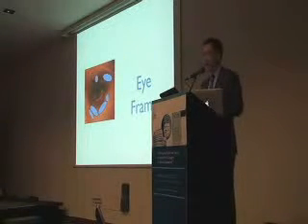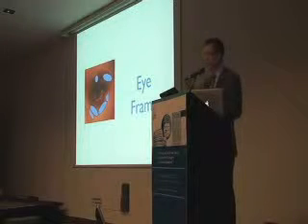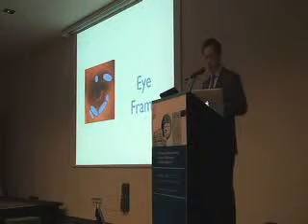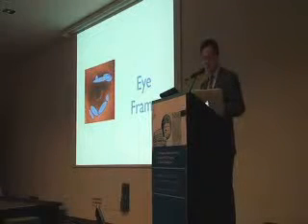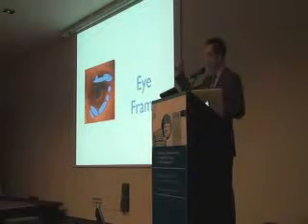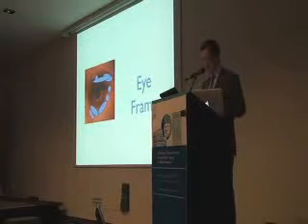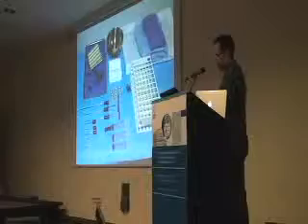And then that A-frame deformity, either due to previous aggressive upper blepharoplasty or due to just advanced aging, you get that notched appearance here. So look for that, and then just overall, a blending in that area. Sometimes I come back and add a little bit more where the transitional phase is. I just see this little dip laterally. I may come in from a lateral point and just nudge it until I see that area blending. So it's all about softening transitions around the eyes. Needle.